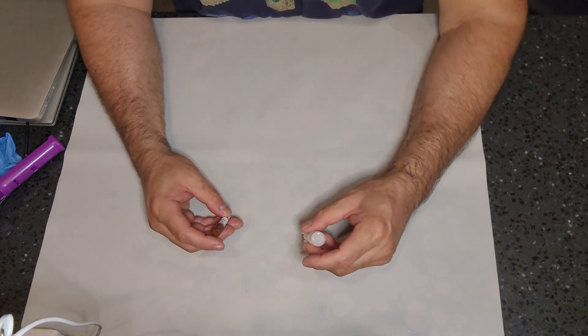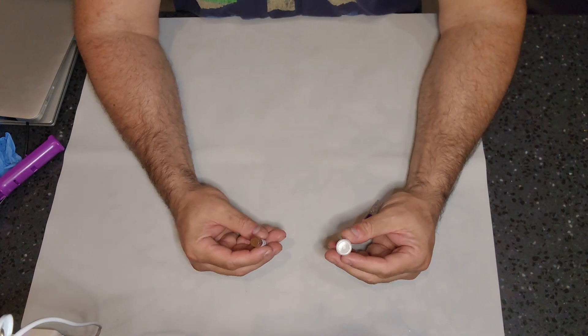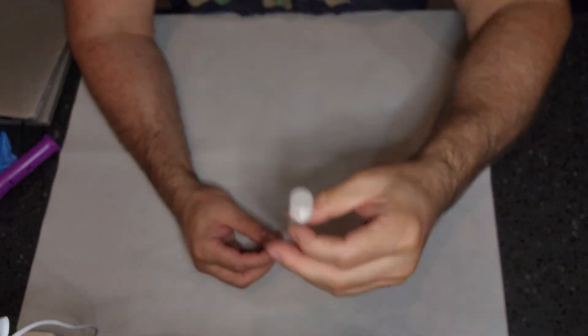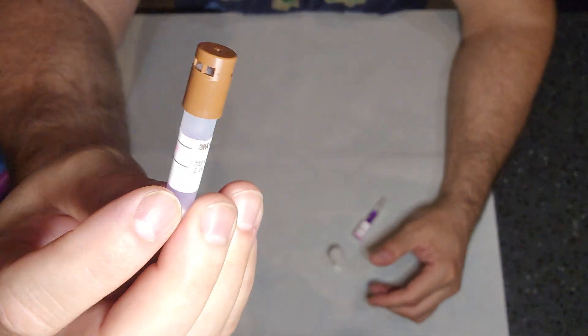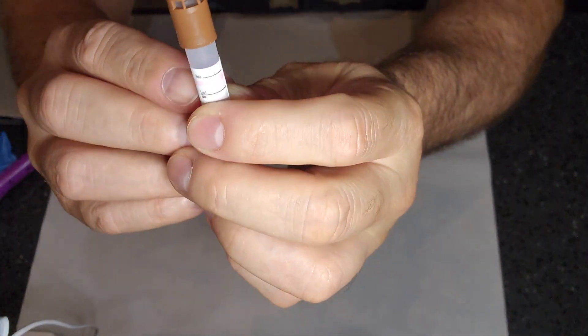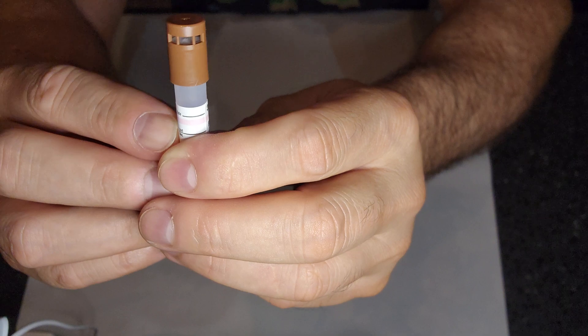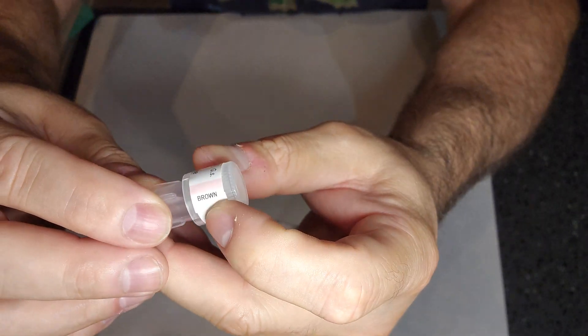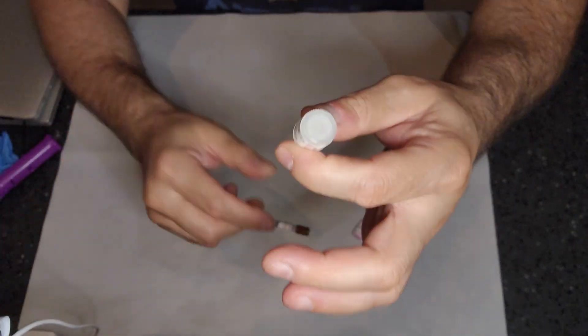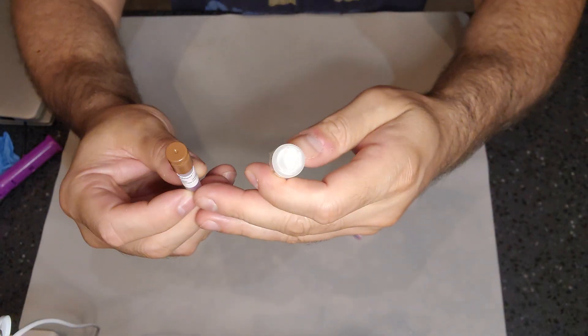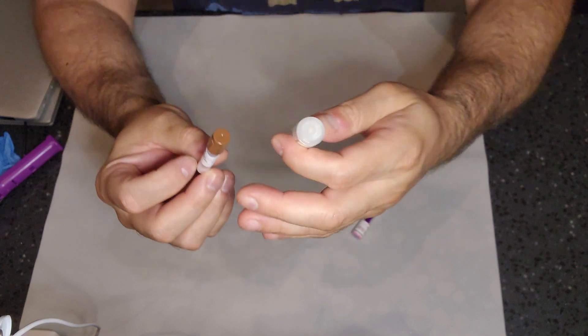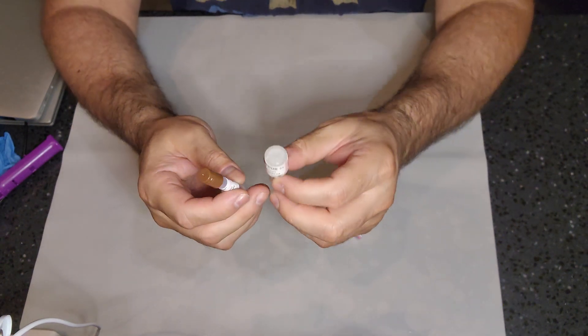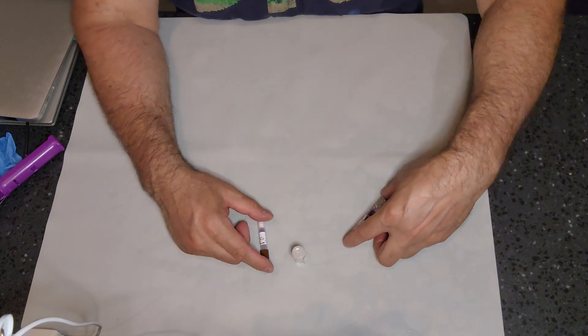All three of these biologicals have the same information on either the cap or on the base. And there is a type 1 indicator you can see right around the base there, and the type 1 indicator on this is right here on the side. It lets you know what color it should change. These two here are used for steam sterilization, the same bacteria of choice, Geobacillus stearothermophilus. Same information on there. Let's talk about this anatomy again.